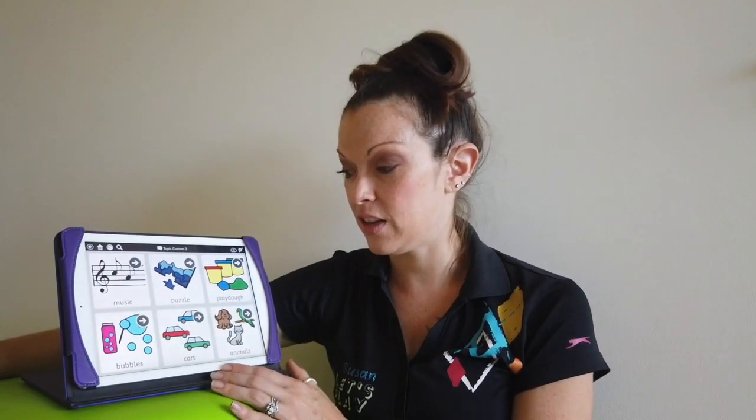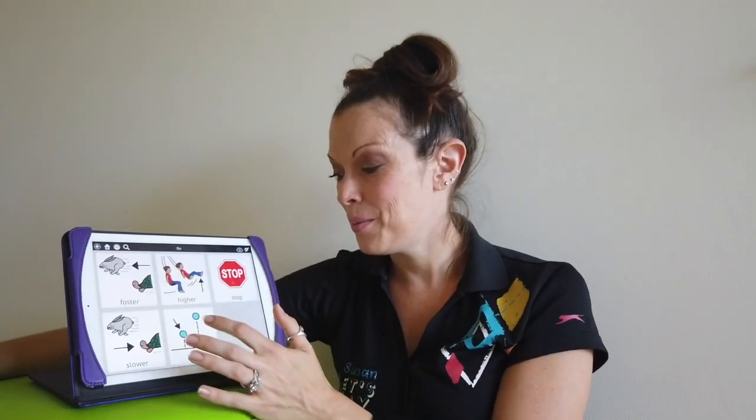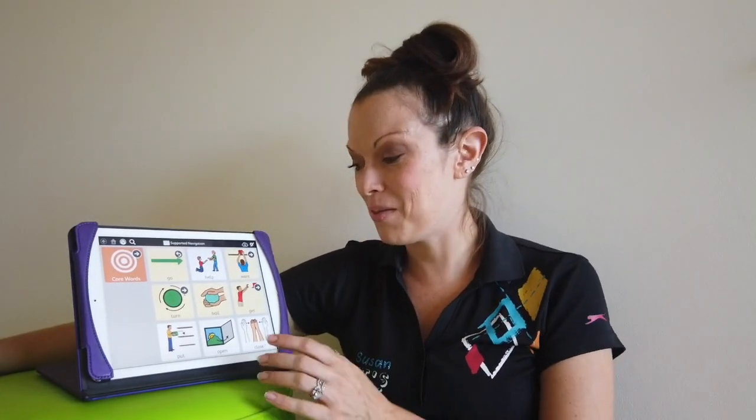I have our different activities in here where we can do bubbles. Bubbles goes right back to here. So after we ask for bubbles, now, where are the bubbles going to go? Higher. Bubbles go higher. Lower. Bubbles go lower. Stomp them with your feet. Stomp, stomp, stomp. And maybe we can also open the bubble container. We can close the bubble container. And that's all after want bubbles.